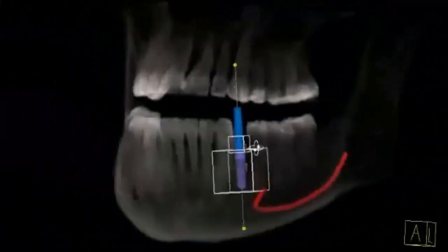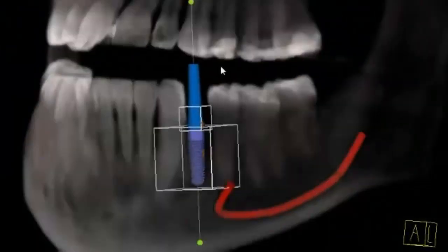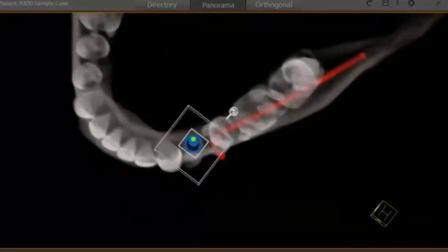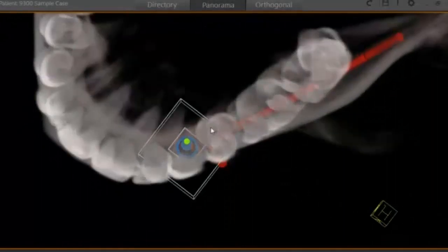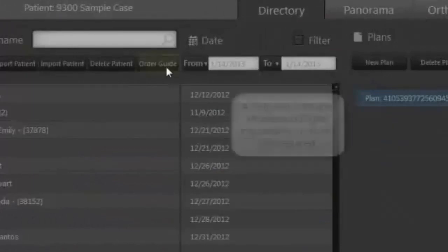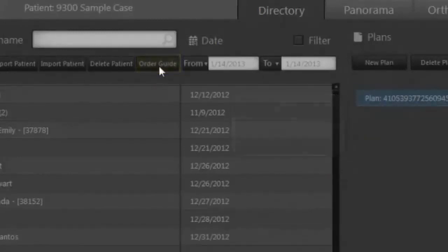Of course, we can always reference our planning in 3D — use this to show the patient. You can clip this back if you want to. Once you're finished, it's very simple: come up to the save button, move over to directory, and click on the Order Guide tab. This will portal the entire treatment plan over to our lab where we will then be able to print out your guide. Thank you.